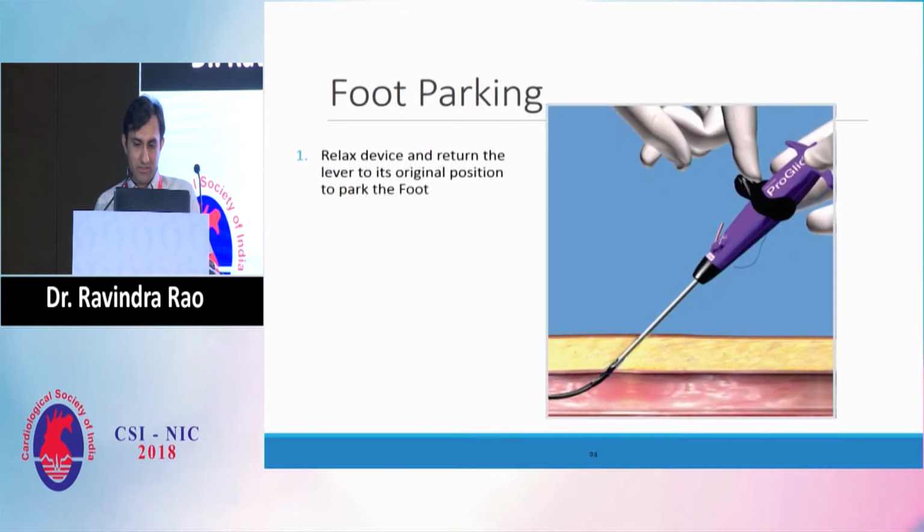Once the hemostasis is achieved, or suppose the hemostasis is not achieved, you have a safety wire in place, you can put your sheath back again. But once there is no pulsatile flow, the sheath comes out, the wire comes out, you pull your blue portion, push the knot with a knot pusher, and once you pull the white thread, the knot gets locked. And then you can go ahead and cut it.